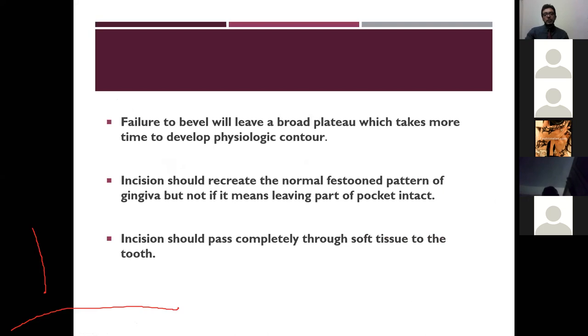Then one most important thing is, while giving the incision, you always have to make sure that it should not form a plateau, a flat bevel. A failure to bevel will become a plateau, and when there is a plateau, it will lead to plaque retentive factors. The incision should always be given to form a normal festooning effect, and the incision should pass completely through the soft tissue to the tooth.